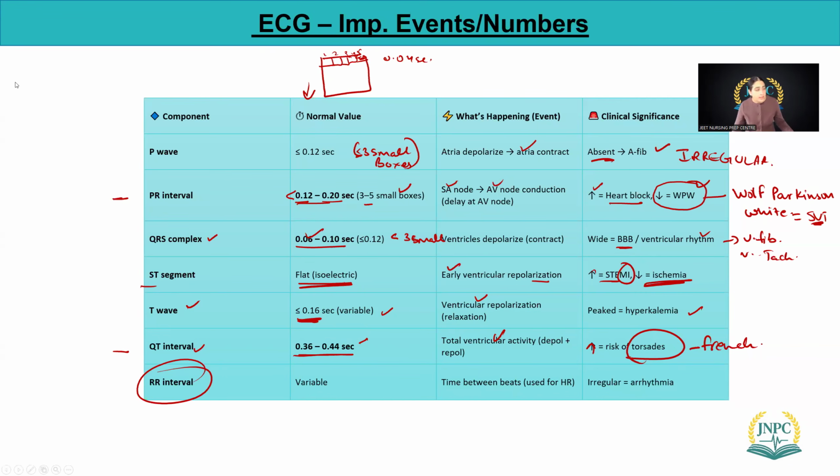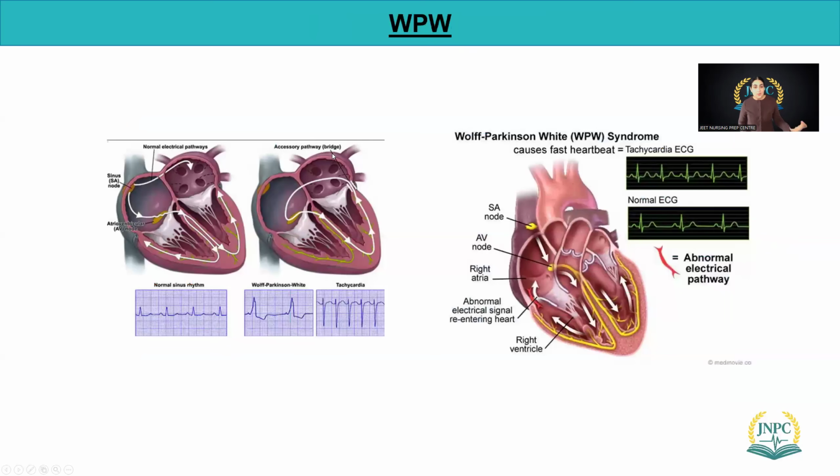Okay. All right. So those are important values, the only thing that you need to memorize. Okay. So maybe take a picture of it and then memorize it. So now let's go to the basics.